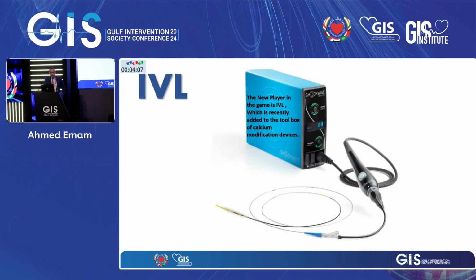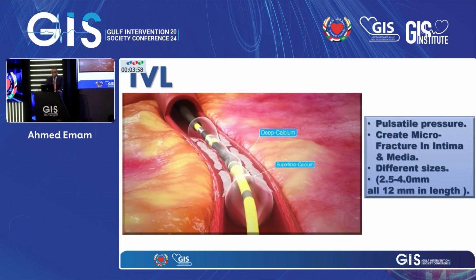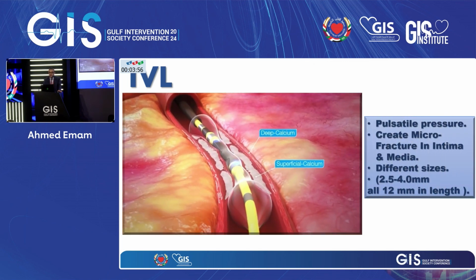So this is the IVL. As you can see here, this is the new player in the game and really a game changer. It gives a pulsatile pressure which creates microfractures in the intima and the media.